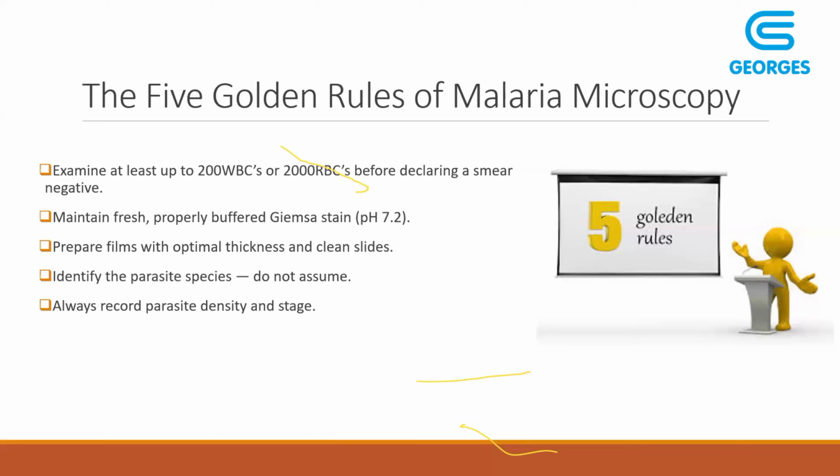Identify the parasite species. Do not assume. The species are helpful in managing the patient. And then always record the parasite density and the stage. This one is also very helpful in managing the patient.